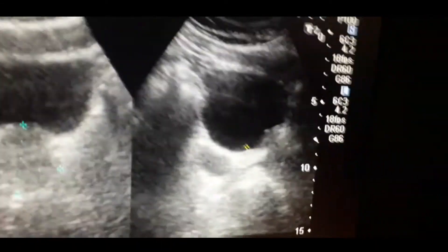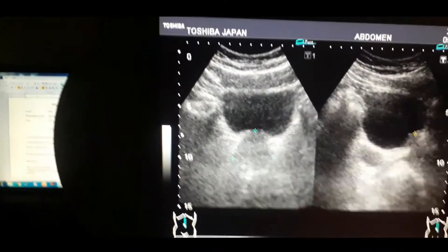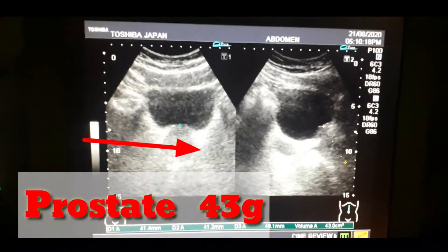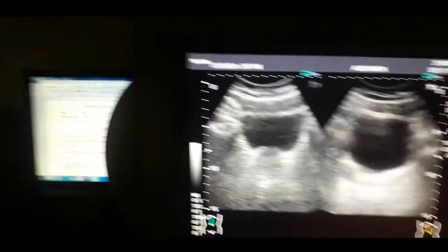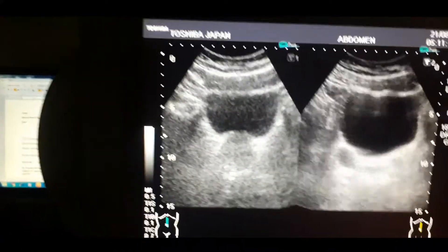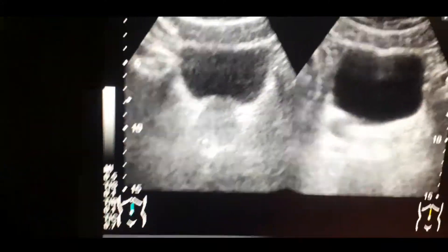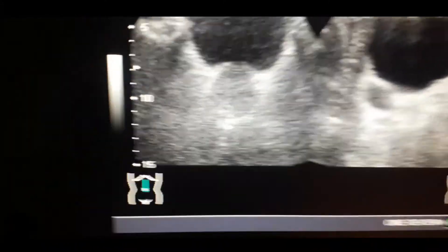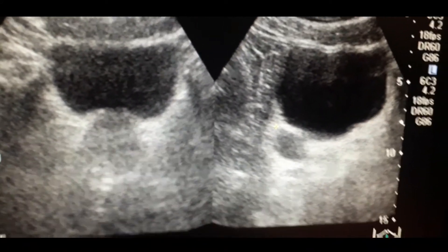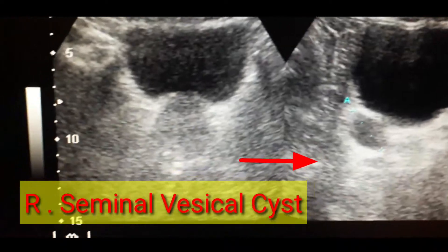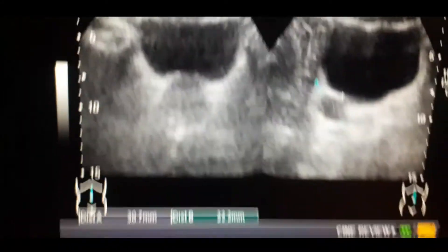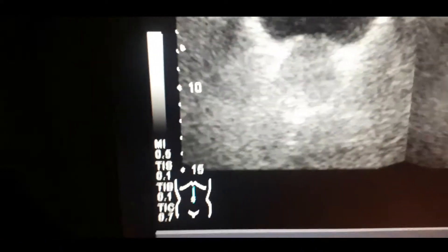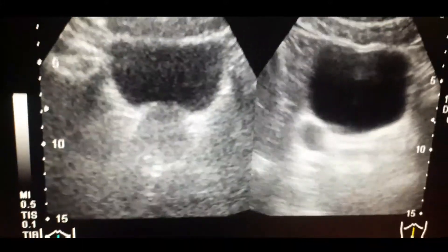The prostate is enlarged. Now you can look at the seminal vesicle cyst that is present on the right side. In the second image, you can see the seminal vesicle cyst — this is the cystic structure. This is the prostate, and now I would like to focus on the seminal vesicle cyst on the right side. You can see the size — it is about 25 x 27 mm.